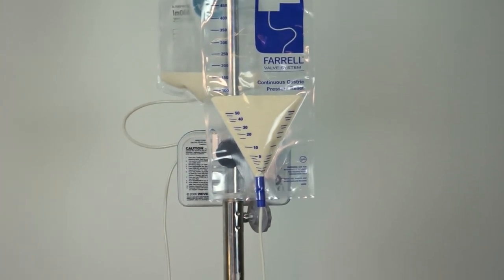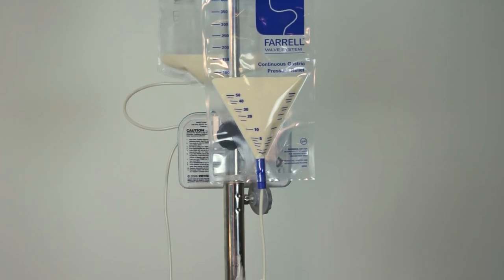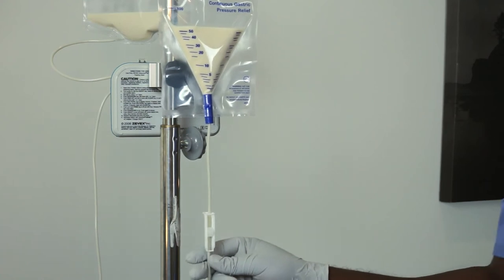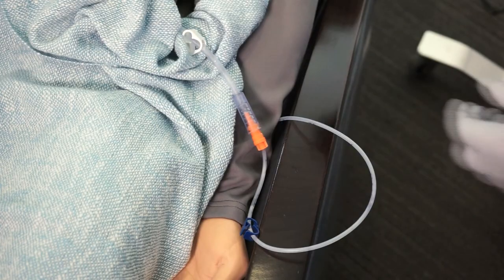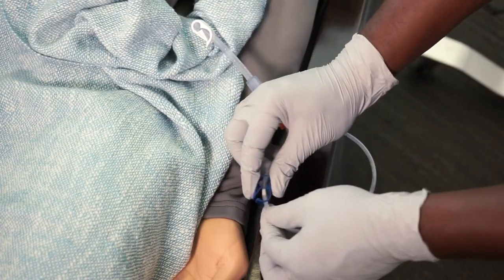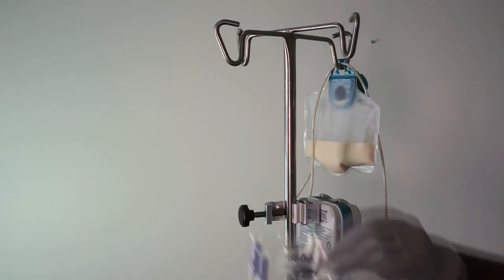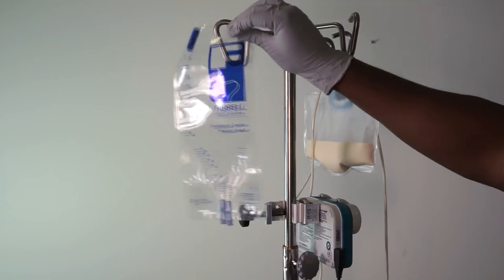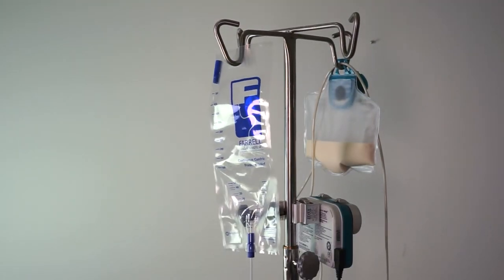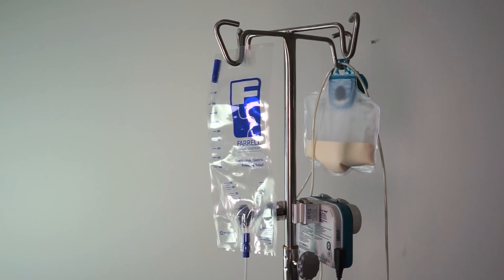If a large volume of fluid is in the Farrell tubing after resolving an occlusion, adjust the white roller clamp of the Farrell bag to prevent a free flow bolus of fluid into the patient. To discontinue Farrell valve operation, close both the white and blue clamps on the Farrell line. Change the Farrell bag when the feed bag is changed. The maximum recommended use of the Farrell bag is 24 hours.